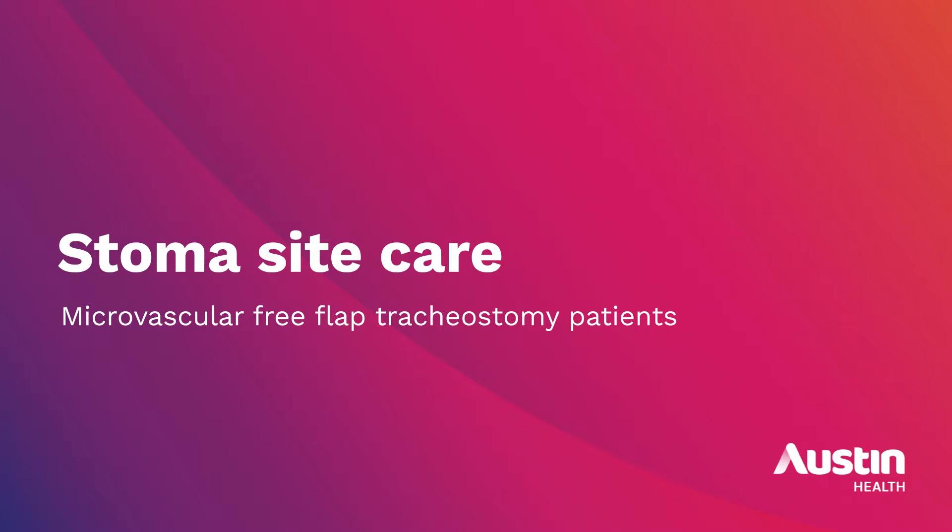This video demonstrates the stoma site care of microvascular free flap tracheostomy patients. This video should be used in conjunction with the OPIC tracheostomy stoma care clinical procedure, which contains further information regarding the care of head and neck surgery tracheostomy sutures.